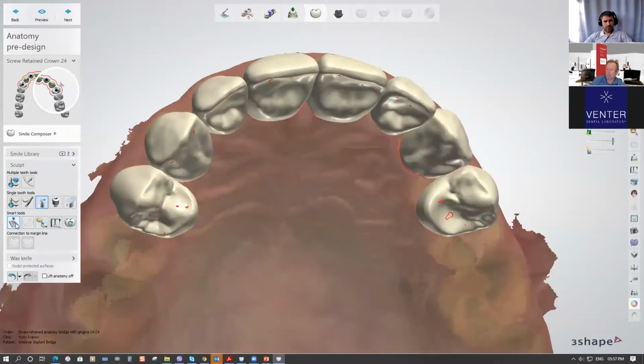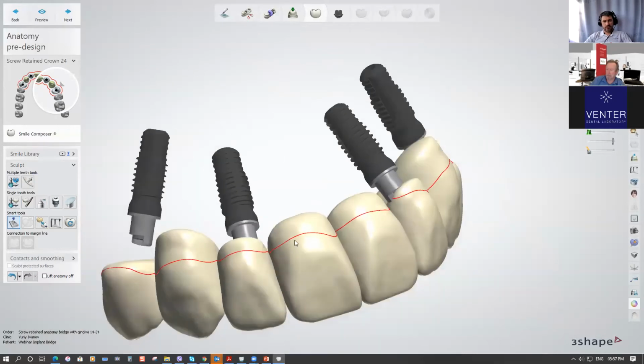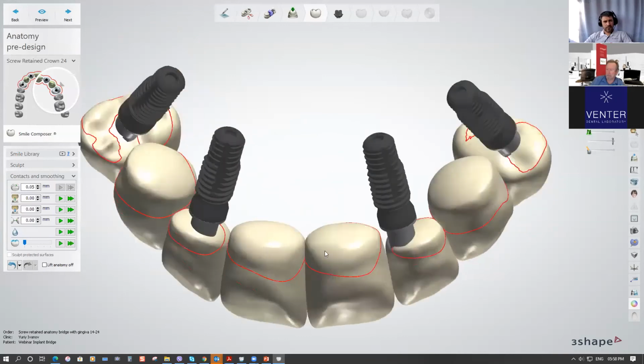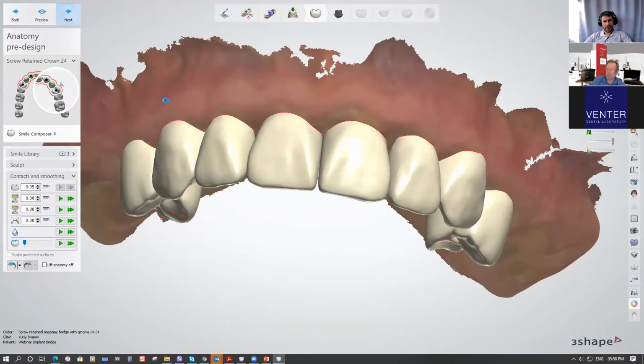And also, what is really important, we need to take care about distance or gap between neighbors. And this is the reason to cut to neighbors in 0 or even with some gap, because we will do the reduction and the cutback of the design, and we need to have our margins to be opened all around every tooth. Yeah, something like this. Okay, and after that, we are ready to come to the next step.